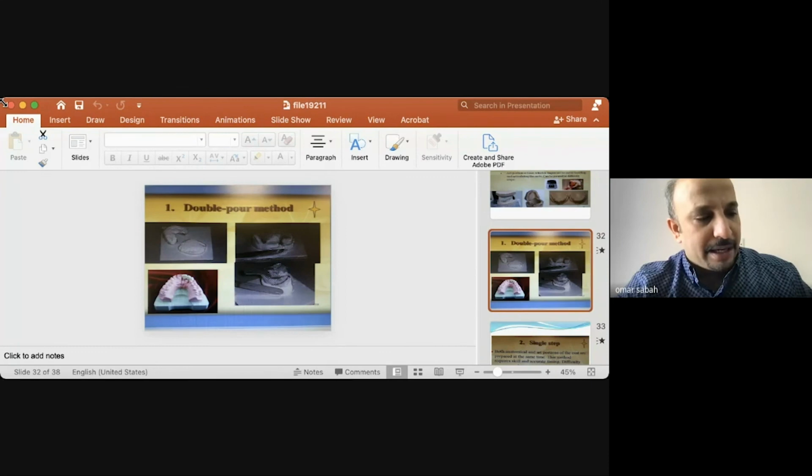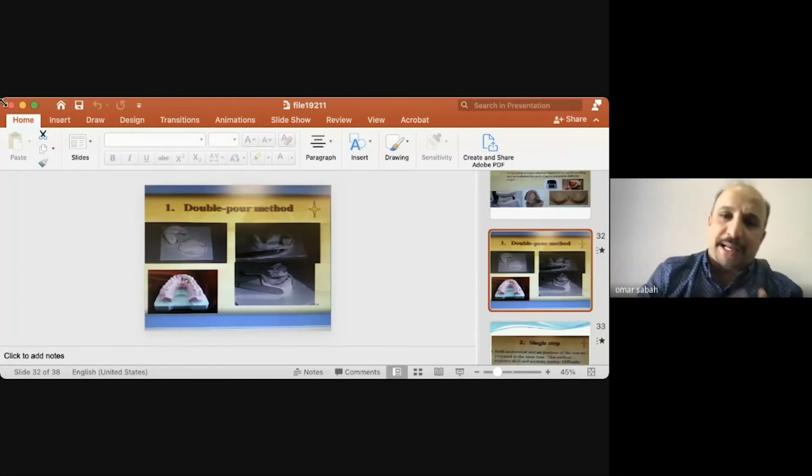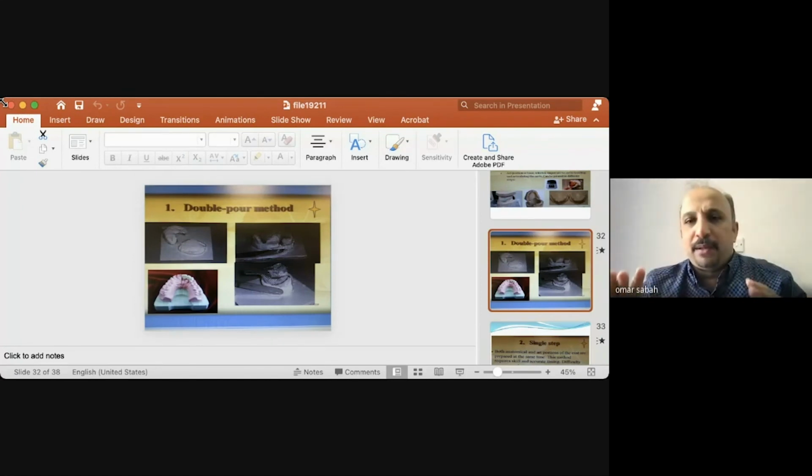الشغله الثانيه، ليش نحن نعمل فاينل امبريشن؟ شوف انا بالنسبه لي الفاينل امبريشن ككيميكال وكفيزيكال بروبرتيز تختلف عن الماتيريال اللي هي استخدمها بالبرايمري وبالسكندري. فالسكندري اذا تشوفهم هسه تلاحظهم بشكل عام كلهم تقريبا فلوبل ماتيريال، يعني واحد كريمي واحد تو بيست، ما ماتيريال هيفي. اوكي، هاي الماتيريال اطيق تفوت بكل مكان، لانه انا الفاينل امبريشن لازم تكون فول ديتيلز.